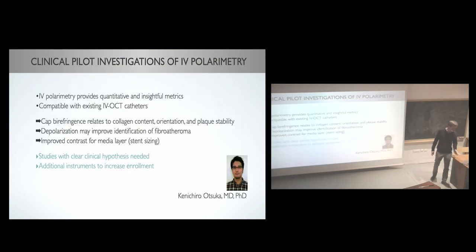So this work has been spearheaded by Kenichiro Otsuka, who at the time was in our group, is an interventional cardiologist, and we now have several plans, at least, for further studies with a clear clinical hypothesis. From a technical point of view, the challenge right now is that this is a custom PS system, and it's difficult to get this multiplied.